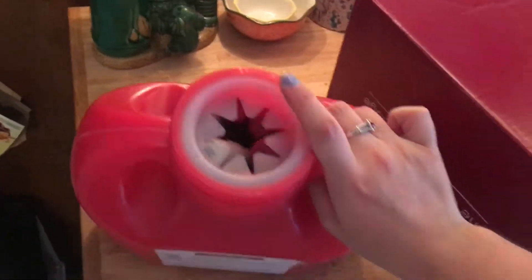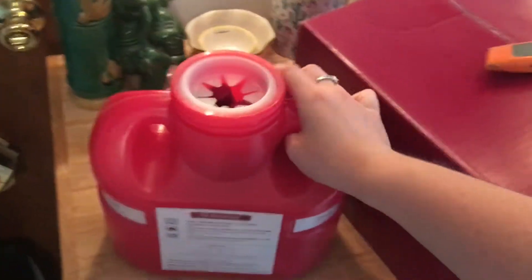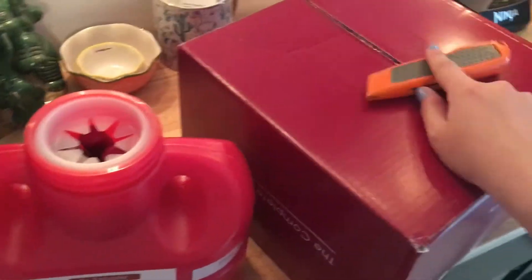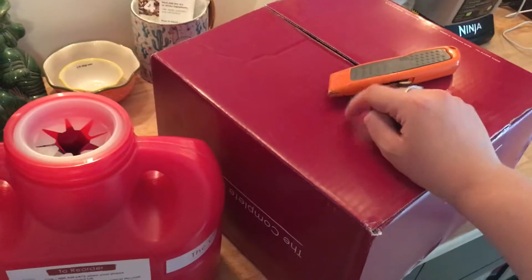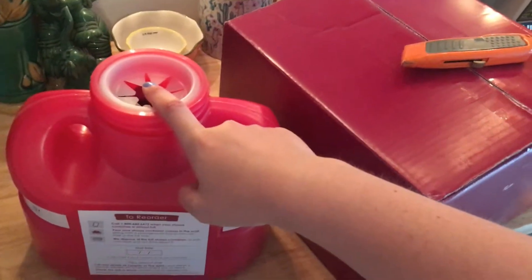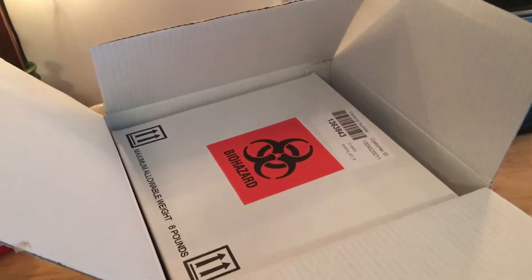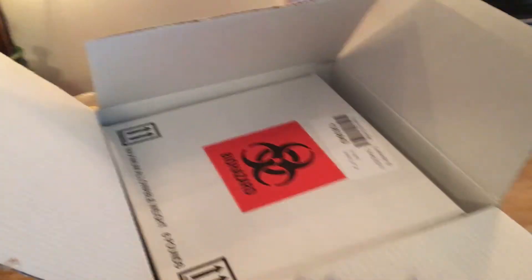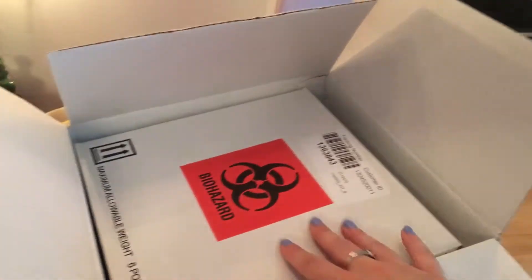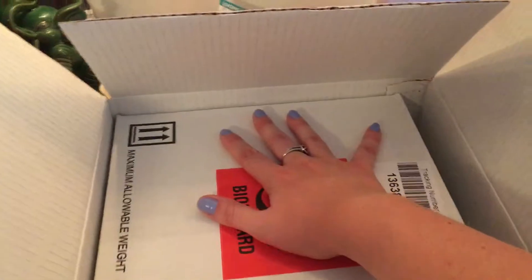This jug is completely full, so in here is going to be a new empty jug and also the box that I send this one in to get incinerated. I'm just gonna walk you through how you do it. This is the replacement box — it's inside another box. That's so this box is not damaged in the process, which is why it's double boxed.